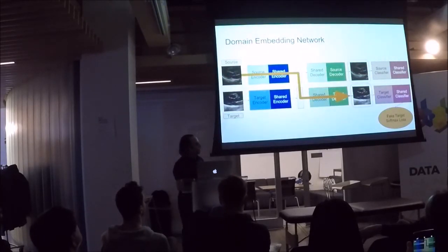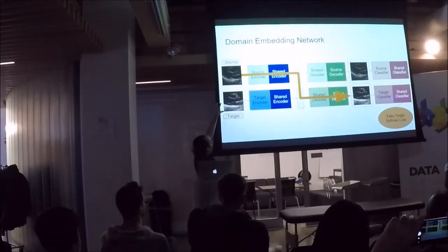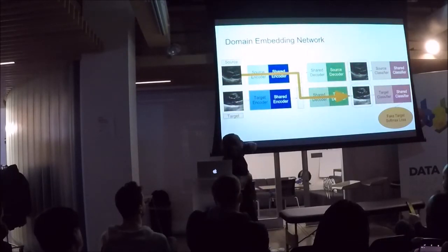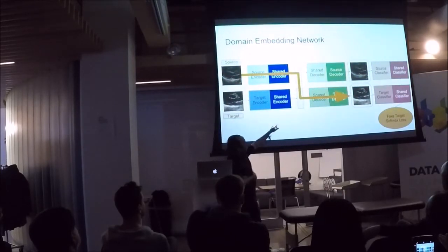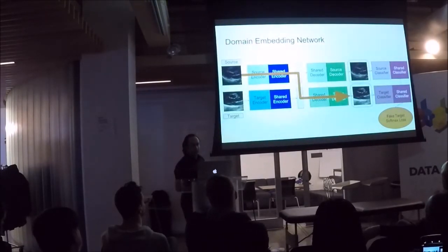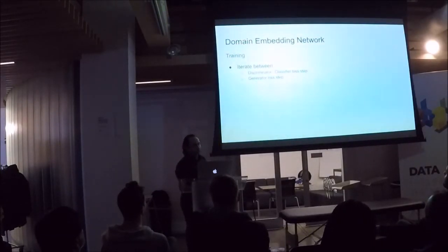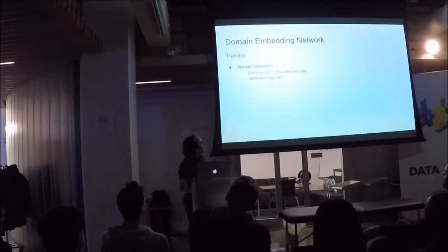There's one really important last bit of the loss. This is what really makes this work. We take our source images, those are Philips images, we encode them as hidden vectors, and then we decode them using the target decoder. That's how we train the thing that we really care about. In this case, it's a classification network, although you'll see we'll swap it out later. In practice, we're going to iterate between training the discriminator and classifier as one step, and then train the generator for everything else.